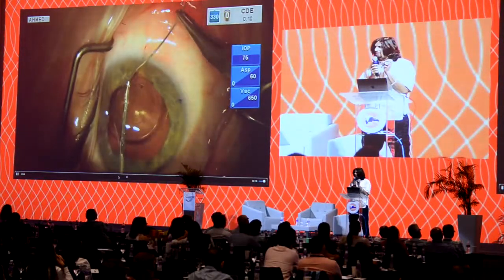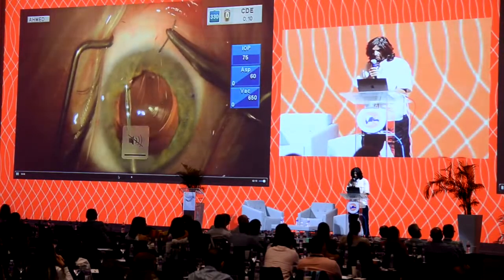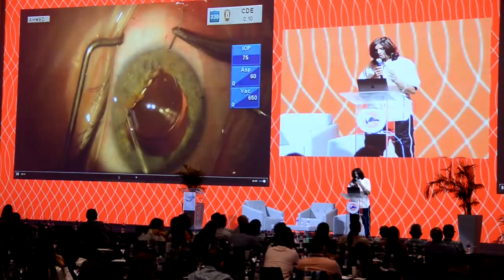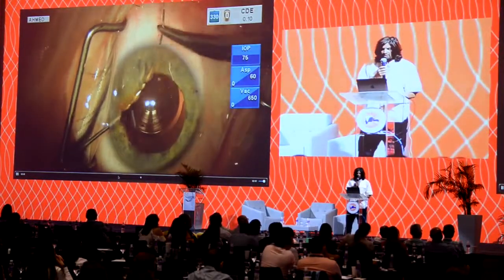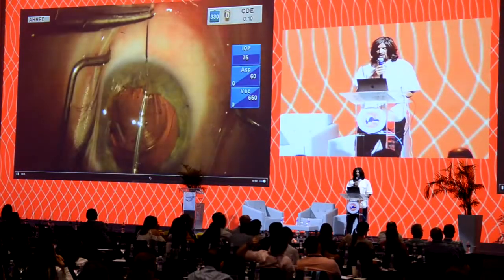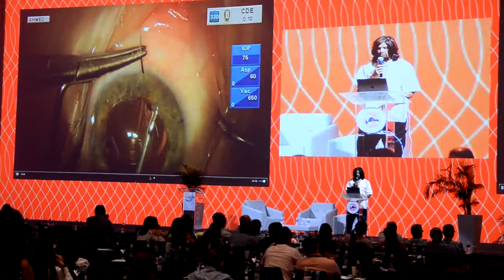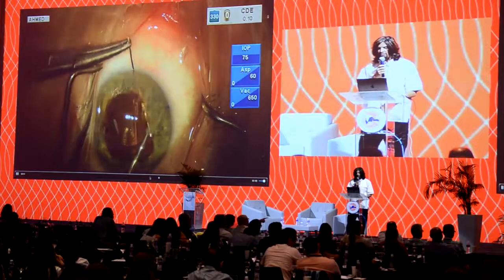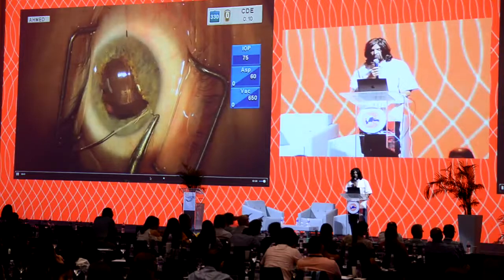The work you see is done not by the needle, but by the forceps. And the forceps are really what makes a difference as far as controlling the iris tissue. You can do about a quarter of the pupil, or about a third at one time, come out through a paracentesis, and then go back in the eye again to continue along here. I like starting nasally and coming toward my temporal incision, and then I can tie through my temporal incision. And notice it's like a baseball stitch, going over and under. The closer the bites, the more round the pupil can be, and continue on.